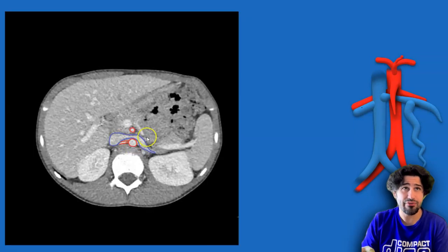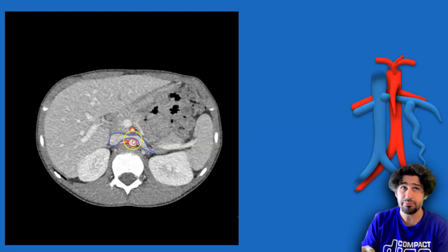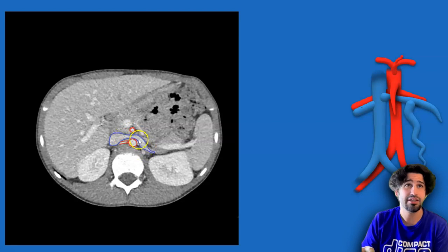Here's a normal left renal vein coursing between the aorta and SMA. You see the aorta here, SMA there, and you can see there's quite a distance between the two vessels and the left renal vein can course through there very cleanly without any compression.